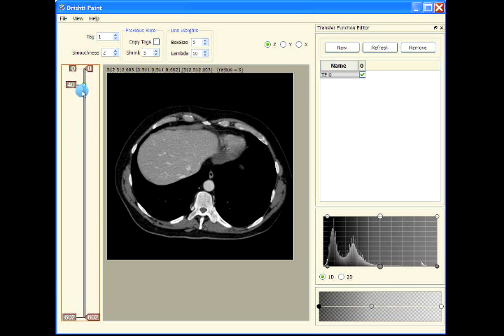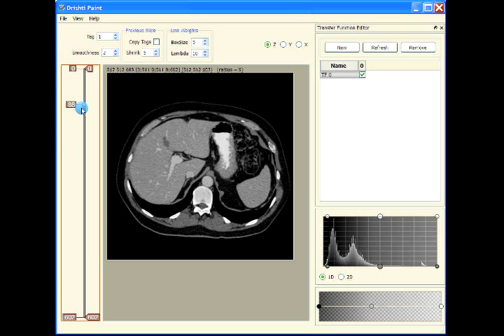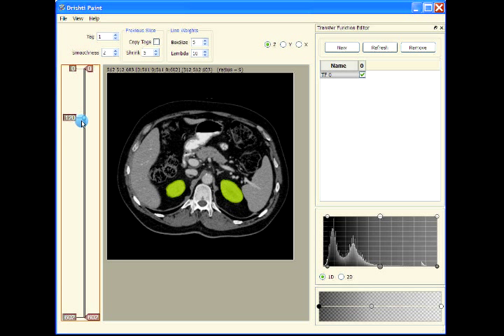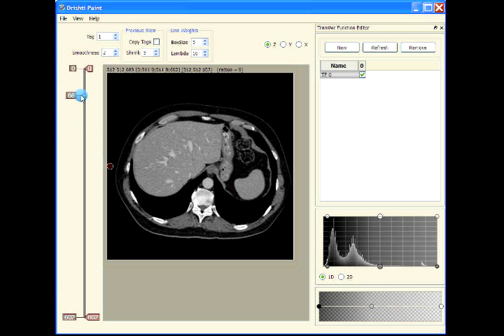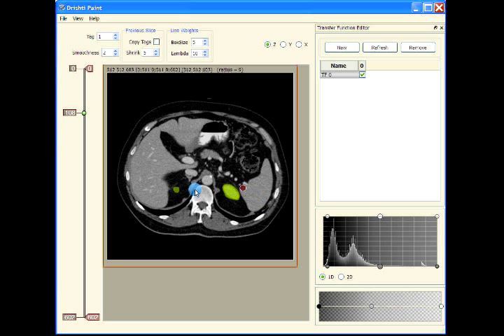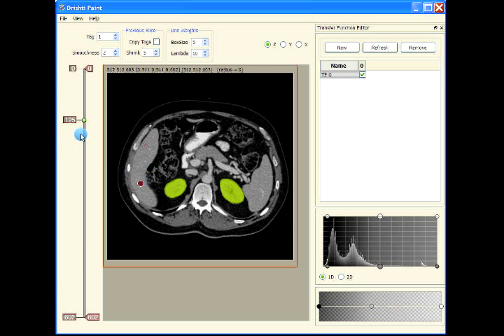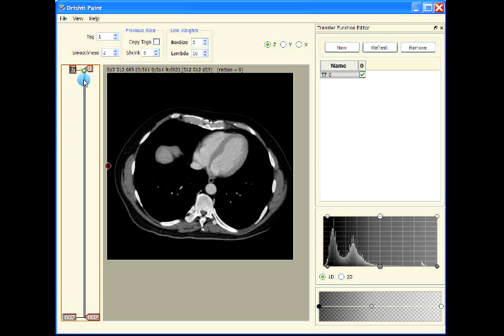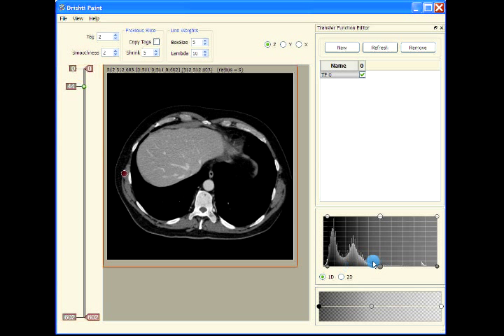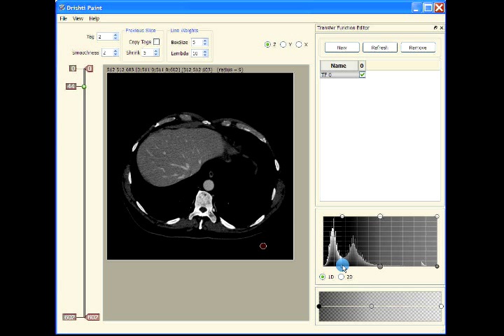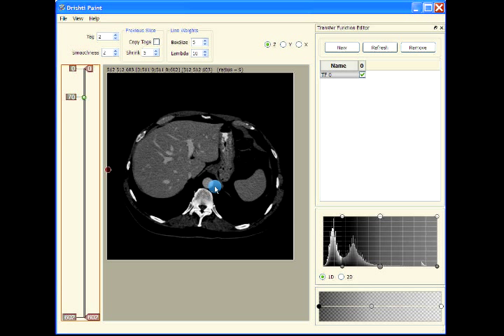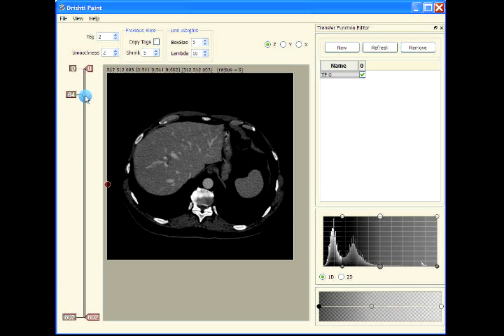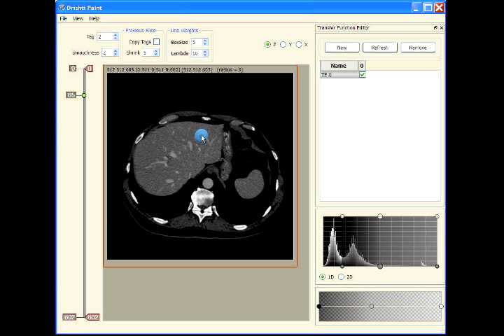This is a human torso dataset. We extracted the kidney in the previous video, and now we will extract the liver. Let's change the tag. We'll change the transfer function to eliminate this yellow region here.